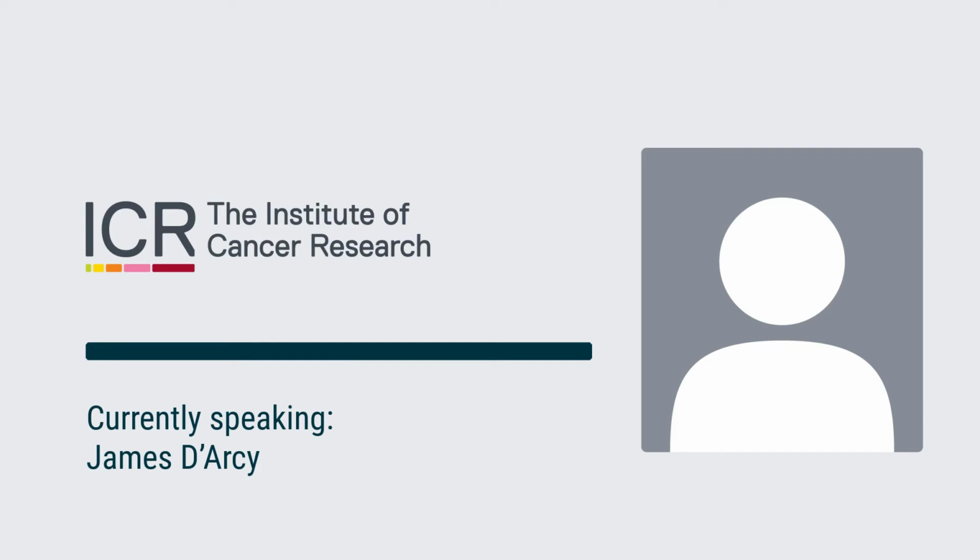And this goes all the way down to the DICOMweb, which is its default method of fetching data, because when you fetch the data back, you specify the UIDs that you want. And NIfTI does not seem to have any way of relating one set of data to another. So without those relationships, which are thrown away in converting to NIfTI, it's very difficult for us to work out what relates to what and then display it correctly.